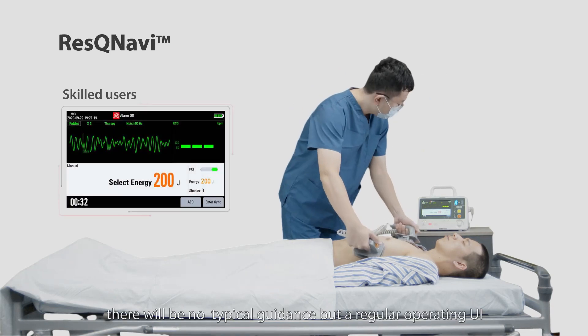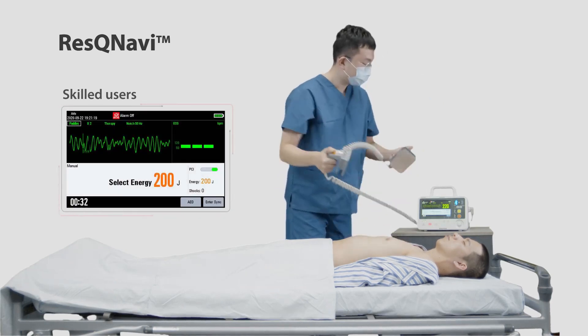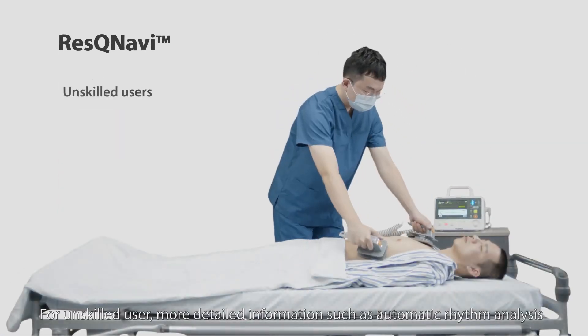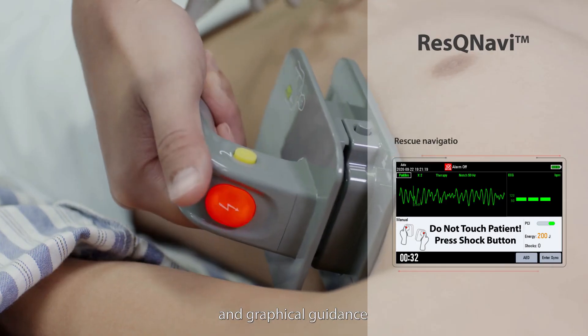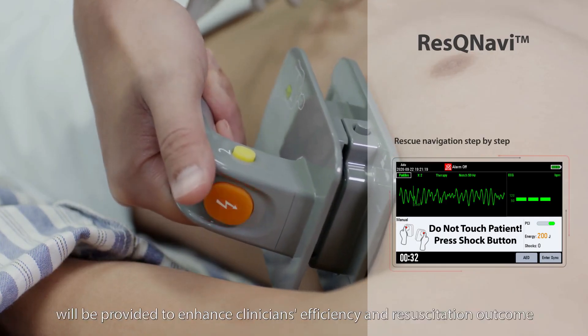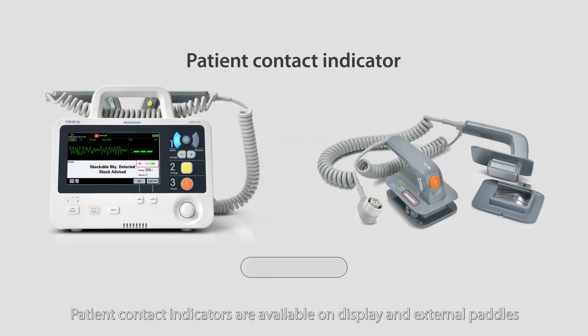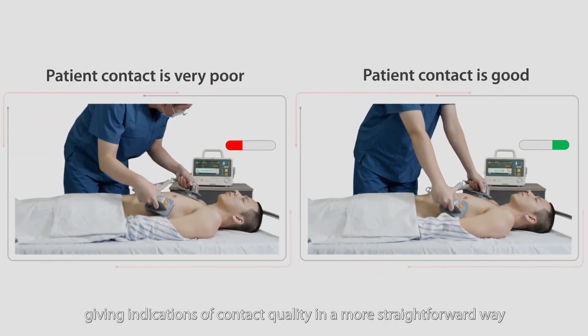For skilled users, there will be no typical guidance, but a regular operating UI. For unskilled users, more detailed information such as automatic rhythm analysis and graphical guidance will be provided to enhance clinician's efficiency and resuscitation outcome. Patient contact indicators are available on the display and external paddles, giving indications of contact quality in a more straightforward way.